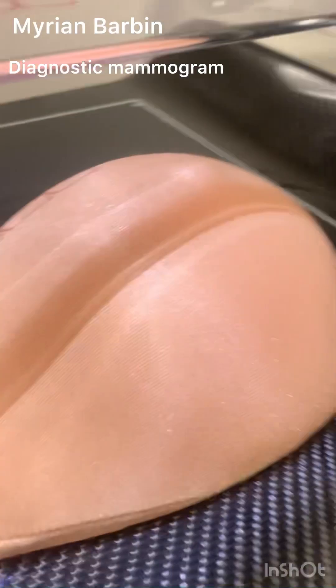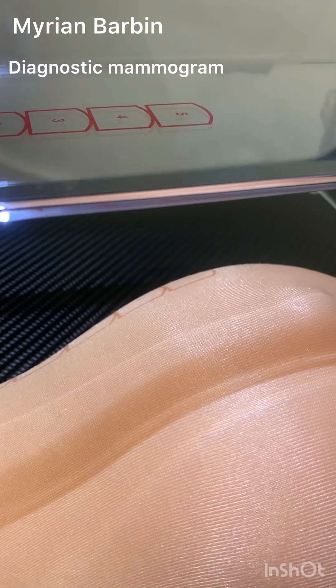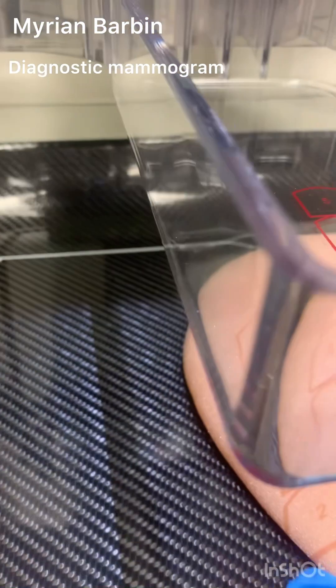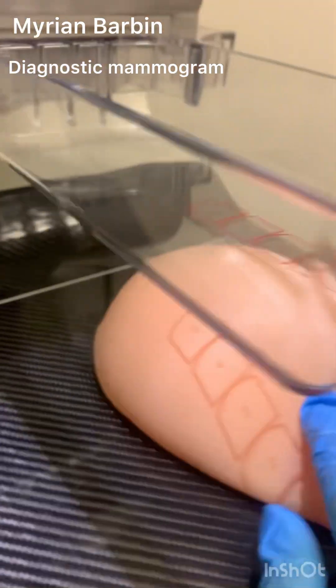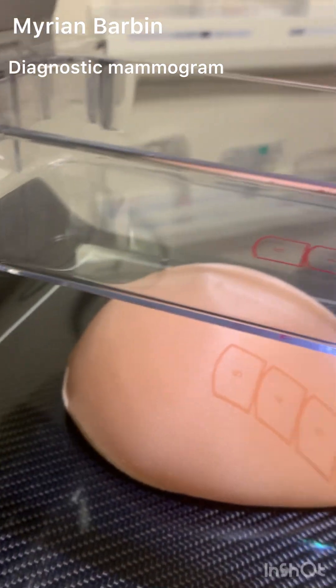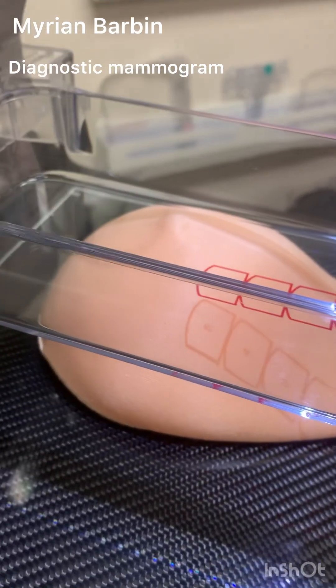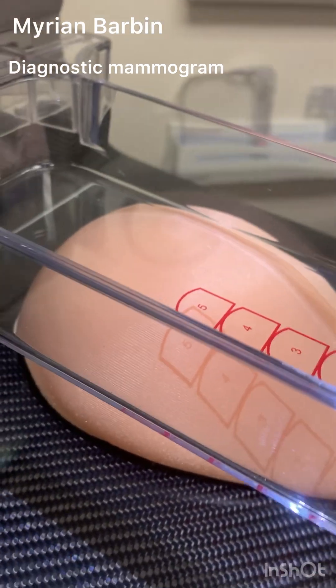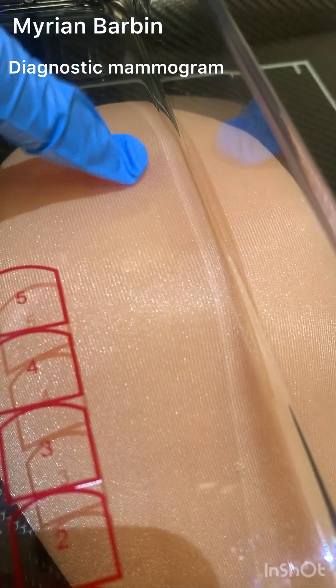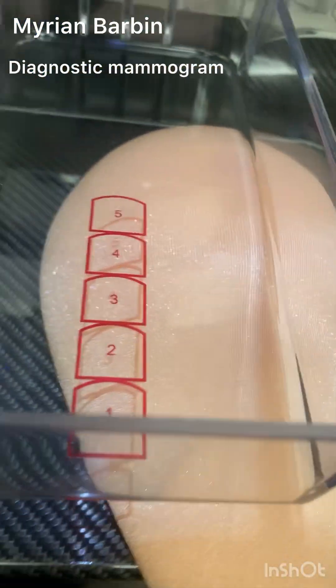Whenever you are compressing, you want to make sure that you are not coming down too tight. You can put your line beside the nipple to get one side of the breast compared to the other, whatever you're looking at. Whenever you come down, check with the patient to make sure that you are not hurting them. Because since this is a smaller paddle, it can feel a little bit tighter.